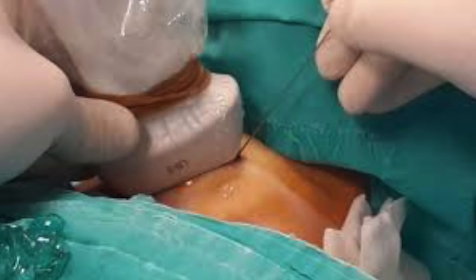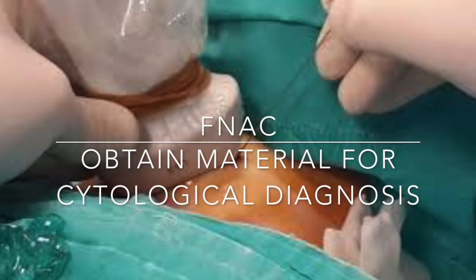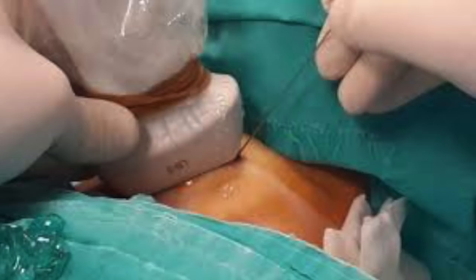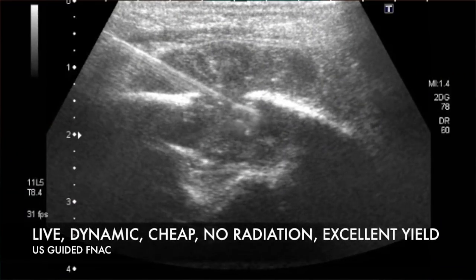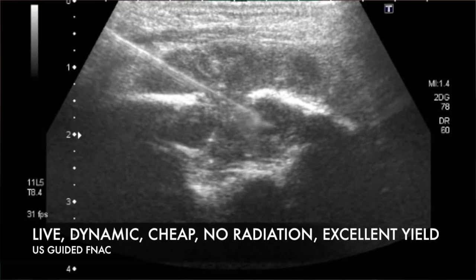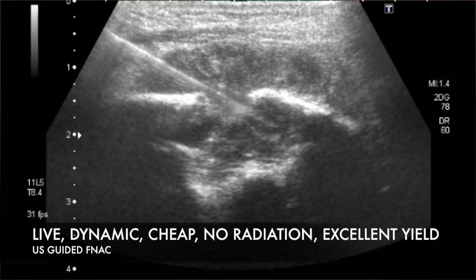FNA is a method of obtaining cellular material for cytological diagnosis using image-guided techniques like ultrasound. We use USG guidance because it is live, dynamic, easily reproducible, relatively cheap, easily available, devoid of radiation, and has an excellent yield.